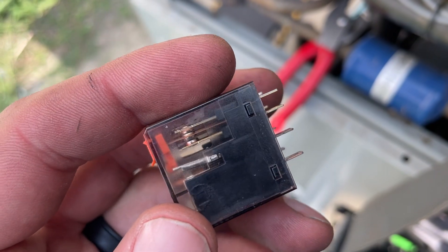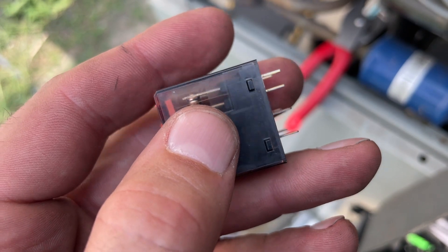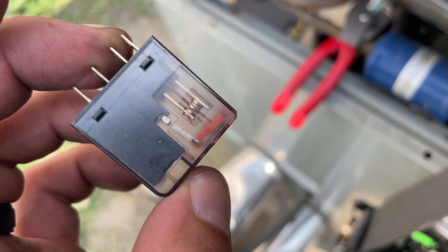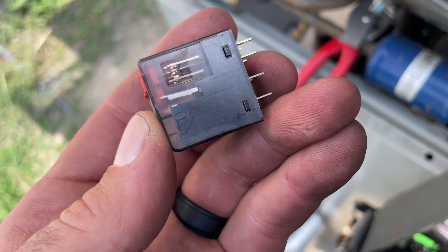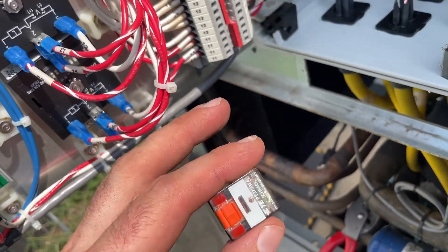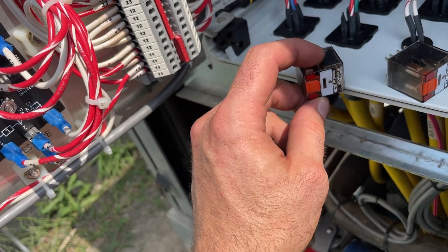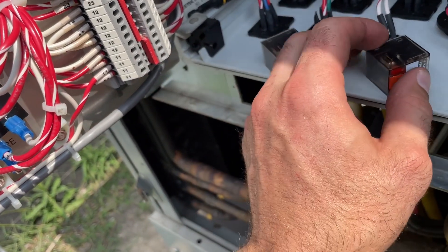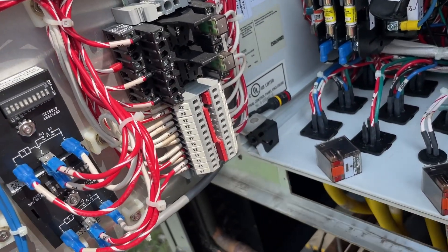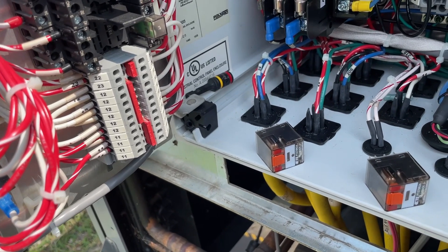I found a problem but I don't think it's the problem. If you look, you can see there's a gap there between the pads — that other one's a more solid connection. In the course of messing around in here, I did see the pump shut off because this relay lost connection. I swapped them out to test them and I think that relay is bad, but I don't think that's our main problem.